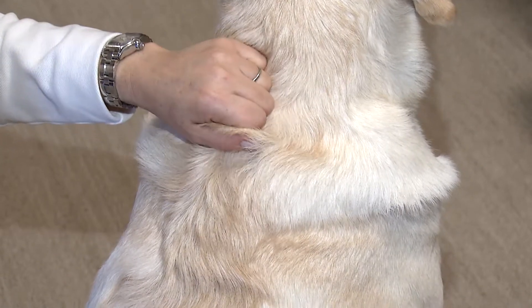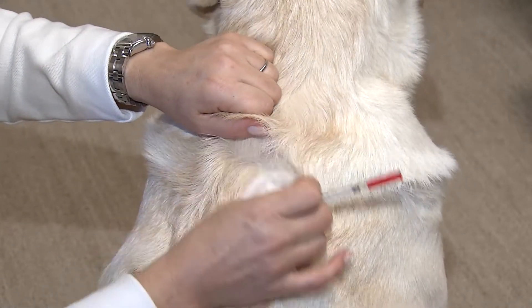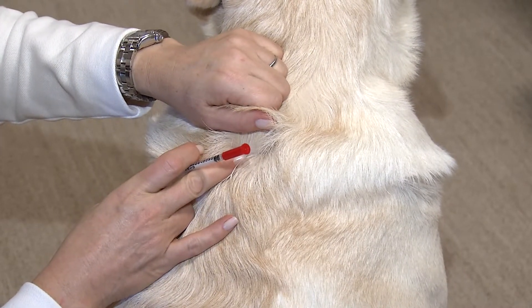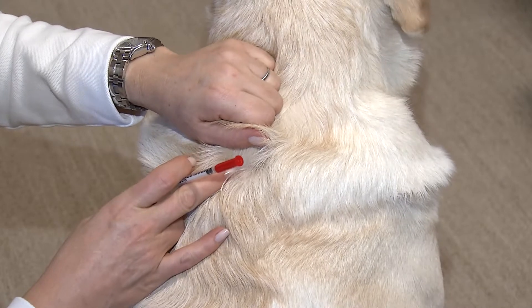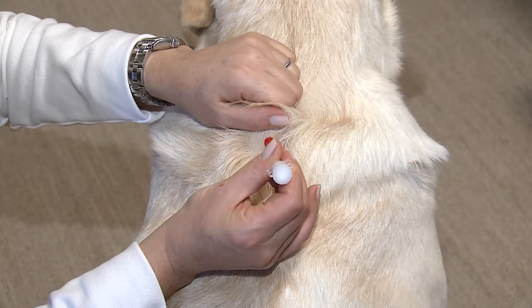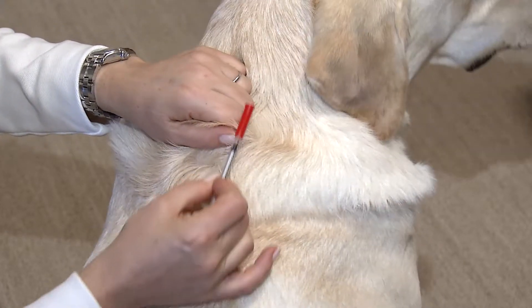When you're ready to give the insulin injection, go ahead and wipe his skin and fur with a little alcohol. That helps you to be able to visualize the skin to make sure where you're giving the injection. The angle of the needle should be approximately 45 degrees — don't go perpendicular, don't go parallel.